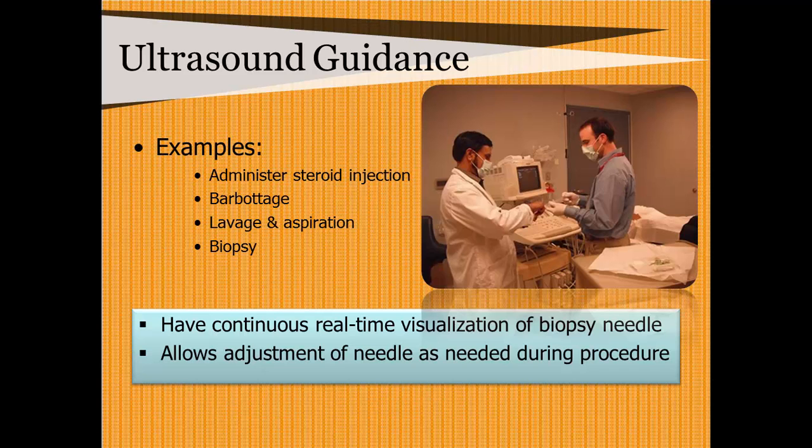So you have continuous real-time visualization of a needle, and it allows for adjustment of the needle as needed during the procedure so that you can make sure that it's in the right place. And it's all done under sterile technique as well.